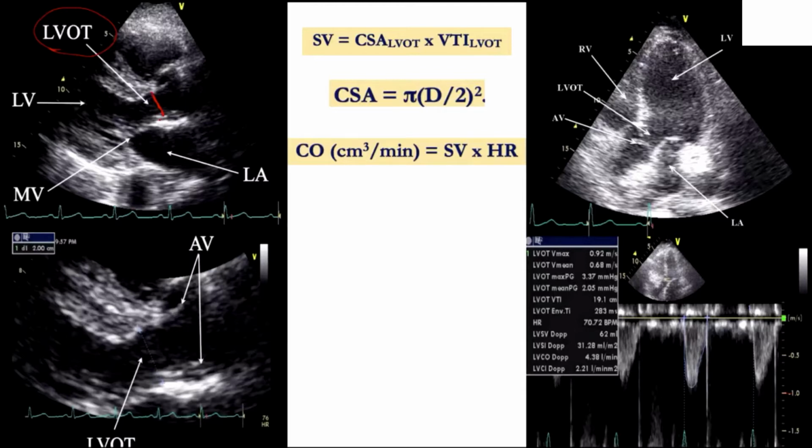Let's say, for an example, you over measure or under measure by 2 millimeters. That's not a lot of space. You're going to actually over calculate or under calculate your cardiac output by 20%. So when you're getting your parasternal long axis view, I want you to zoom in on this area here, which is going to help you place your calipers for measurement, but it's also going to direct all those ultrasound waves into that specific area and give you a more clear picture.